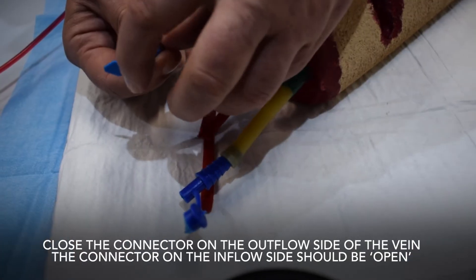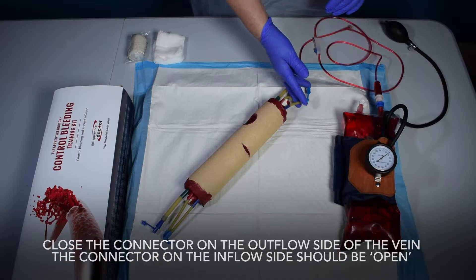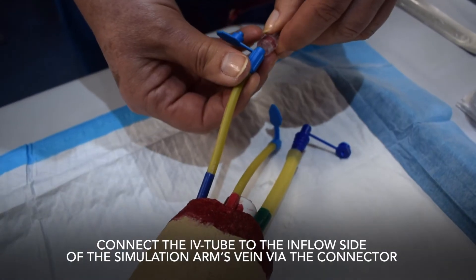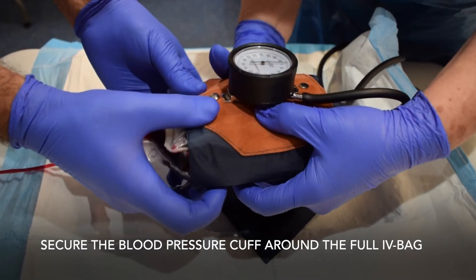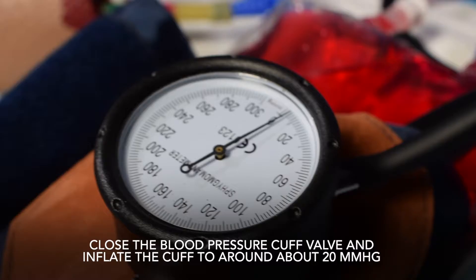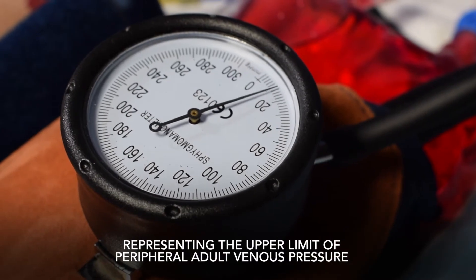Close the connector on the outflow side of the vein; the connector on the inflow side should be open. Ensure that the IV tubing roller clamp is in the closed position. Connect the IV tube to the inflow side of the simulation arm's vein via the connector. Secure the blood pressure cuff around the full IV bag, close the blood pressure cuff valve, and inflate the cuff to around 20 mmHg, representing the upper limit of peripheral adult venous pressure.